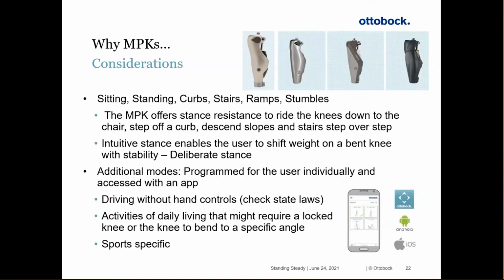And I think that's the biggest thing early on. You certainly can read the manual and recognize what the knee is going to do in certain circumstances, but you have to learn that it's really going to happen, and you have to learn to trust that. And I have learned to trust most of these situations: sitting, standing, curbs. I think the stumble recovery feature, if I were to pick one of these, I don't know how often that kicks in, and I don't recognize it because of the intuitiveness of that feature.